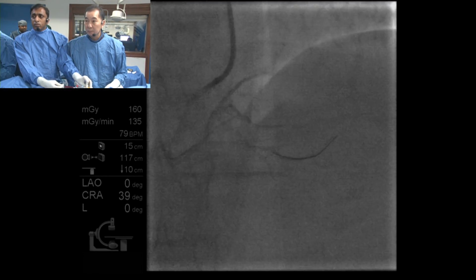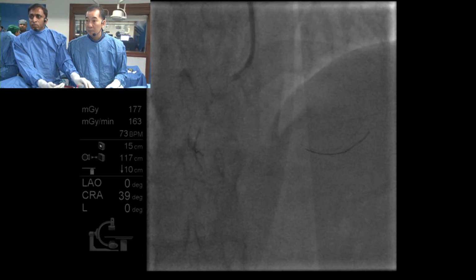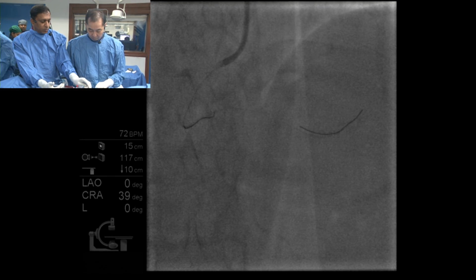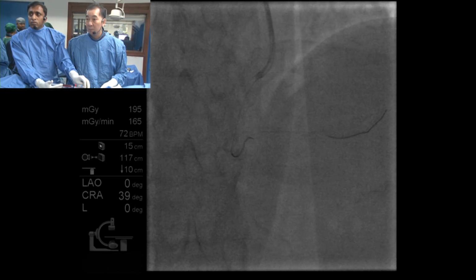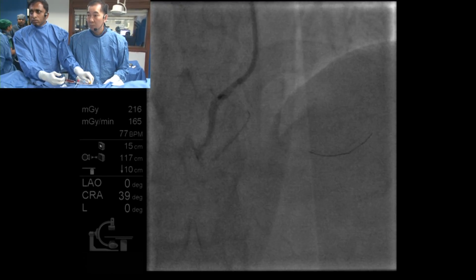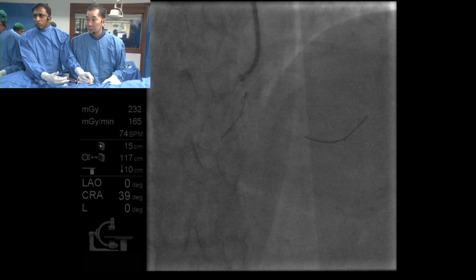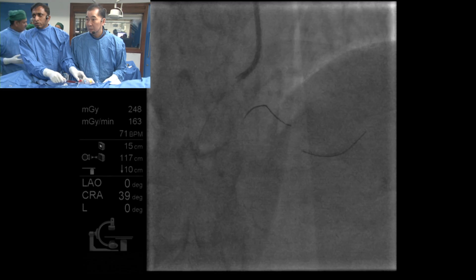Let me ask you, Luis Guzman here. Even if you are considering a single stent technique, you want to predilate, or dilate the ostium of the PDA? When there's 50% or more lesion, I would do that, yeah. And then what result will you accept after this predilatation to say, okay, I'm going to change technique to a double stent directly rather than a single stent, or you do not use that predilatation as an indication for that? When there's TIMI 3 flow and less than 70% stenosis, then I tend to leave the side branch alone. That's good. All right.